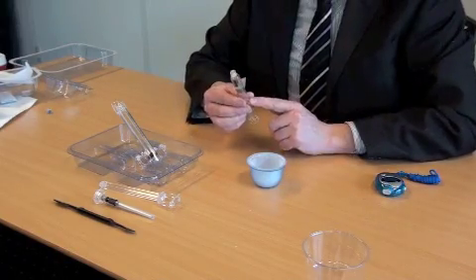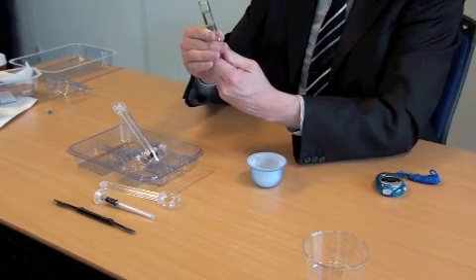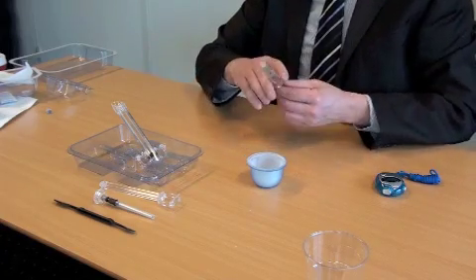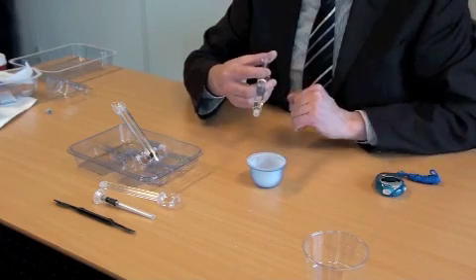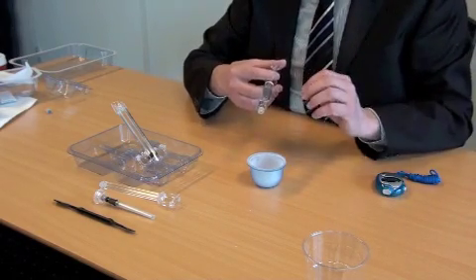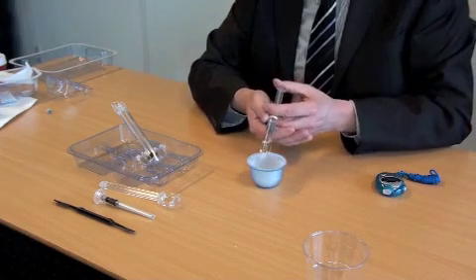and before we inject the liquid into the bowl, there's a trick. We first retract a little bit, because then you will see that it is easier to inject it into the powder in the bowl. When we inject it, the best is actually to inject it via the side of the bowl. And at the moment that we inject it over there, the clock starts to tick, because we have to make sure that the preparation of Hydroset is exactly according to the time limits. Okay, we're now going to inject it.